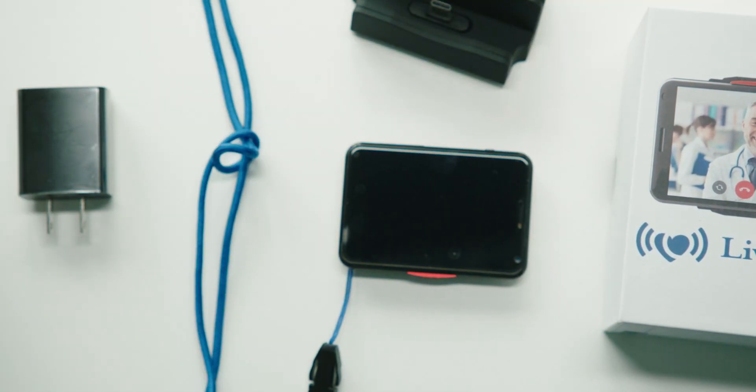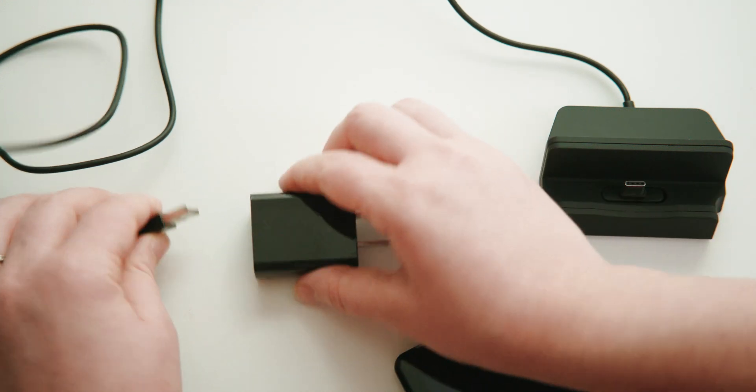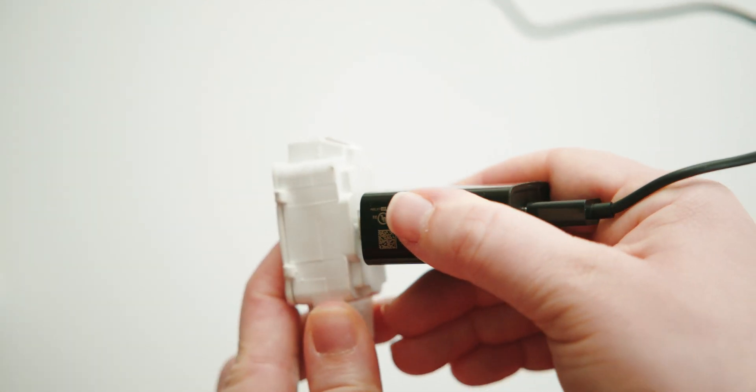The best way to set up the Link Plus is to always keep it attached to the docking station. Pick a place where you have good cell service and easy access to an electrical outlet. Then plug in the USB cable from the docking station into the power brick, followed by the power brick into an electrical outlet.